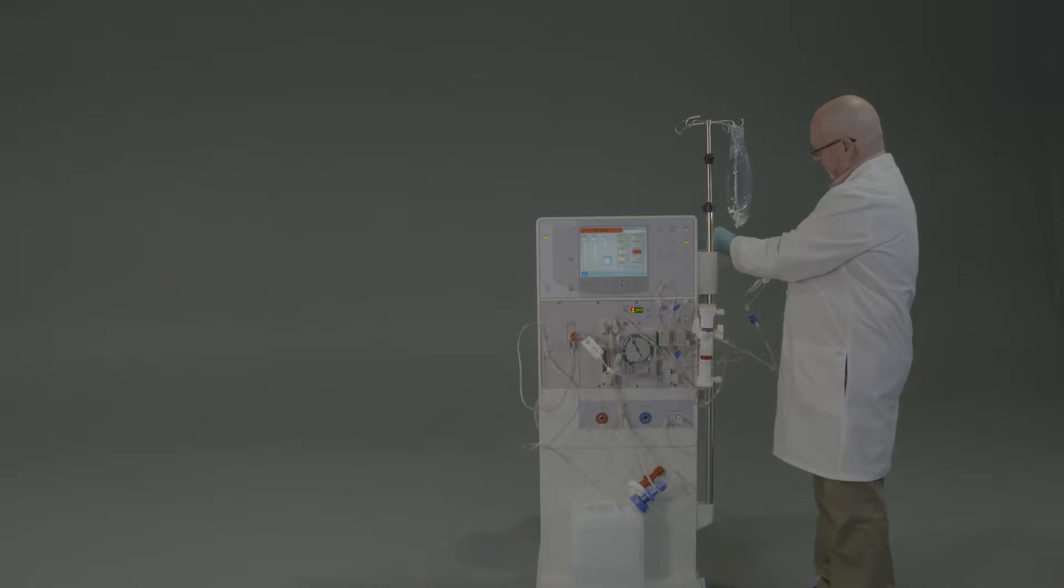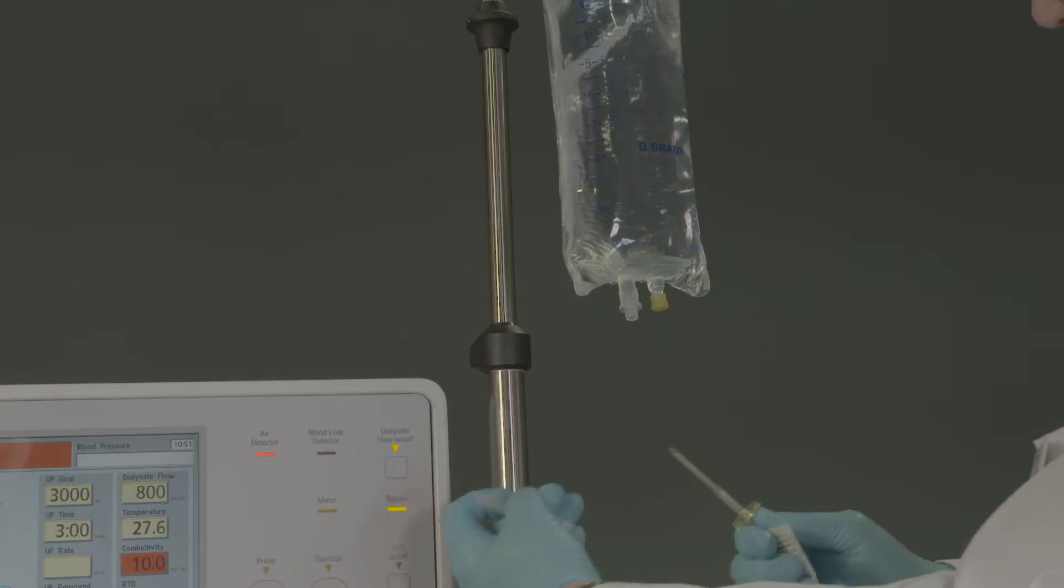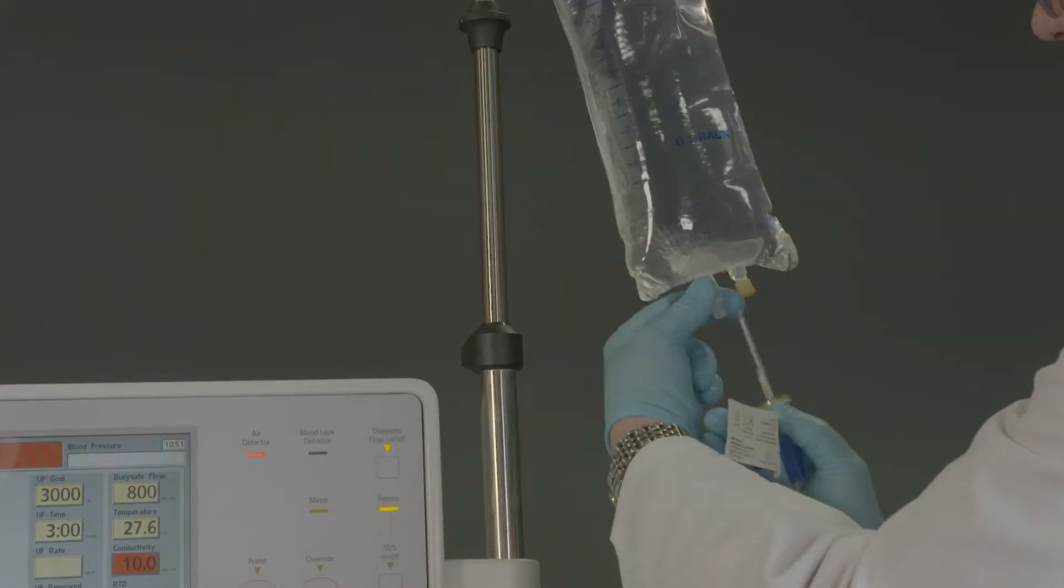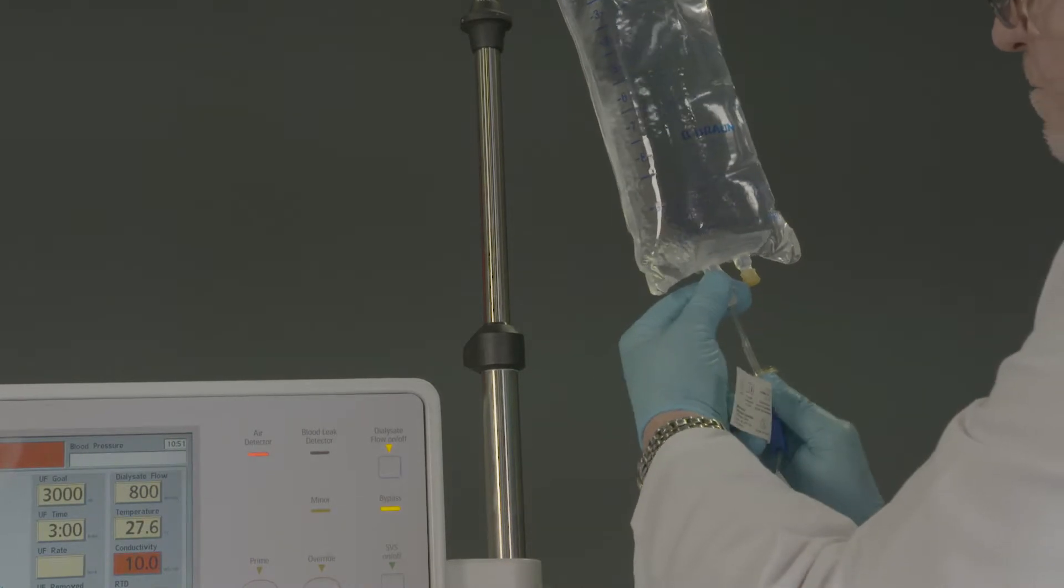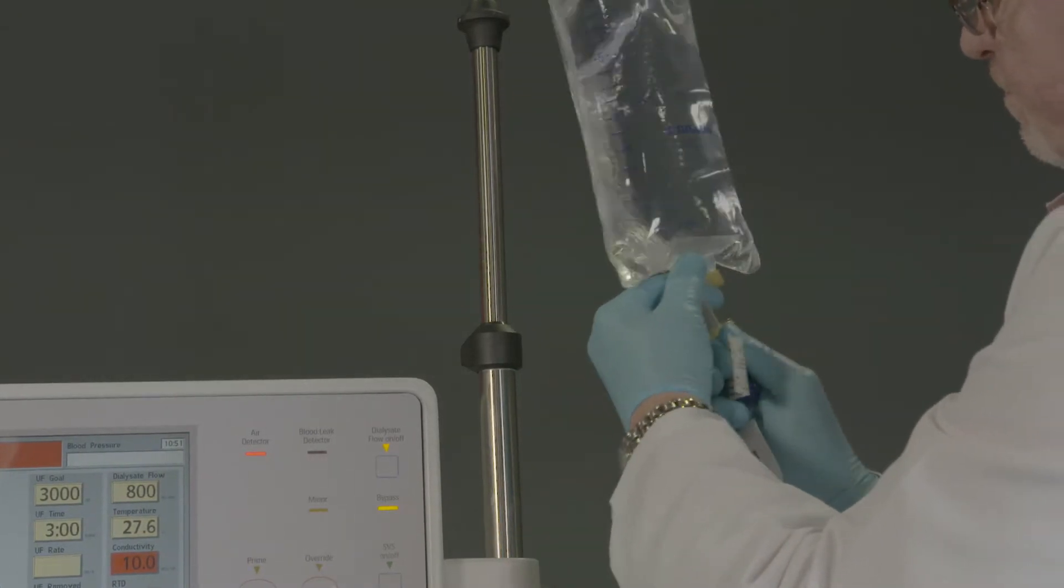The first step is to ensure that the dual spike is fully inserted to the disc. If you need to insert further, use a back-and-forth insertion motion, which will prevent tubing kinks.